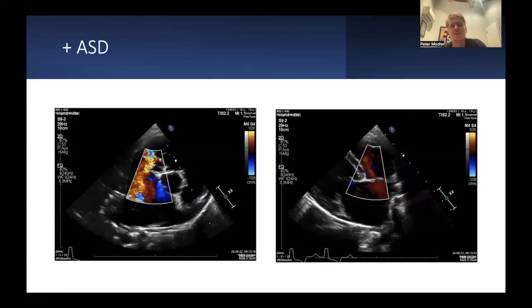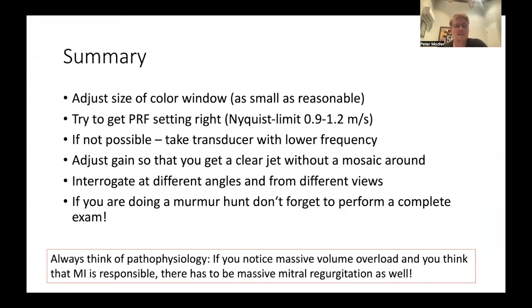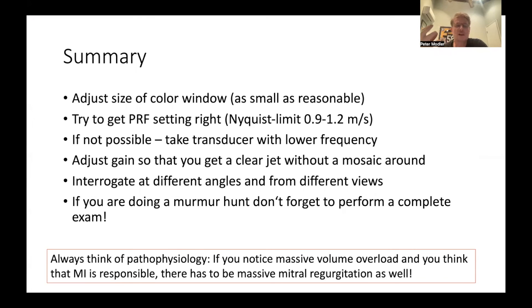To summarize: adjust the size of your color window according to the structure you want to see — a color box much larger than the left atrium lowers frame rate without giving more information. Get the PRF setting right so the Nyquist limit is always between 0.9 and 1.2 meters per second; if not possible, choose a transducer with a lower frequency. Always adjust the color gain to get a clear jet without mosaic artifacts around it. Always interrogate your mitral valve at different angles and from different views to get a good estimate of jet size.